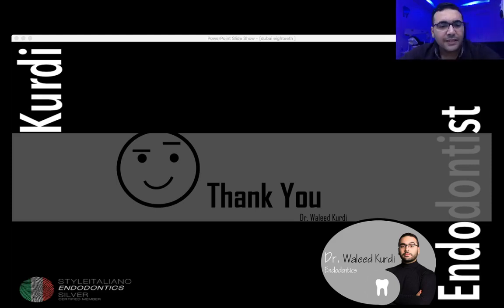Should the separated instrument be loose before using the BTR pen? Here is the start of good questions. Dr. Abdul Halim, he's a great dentist, by the way, asked if we should loosen the file first before using the BTR pen. No, and this is a surprise for you.